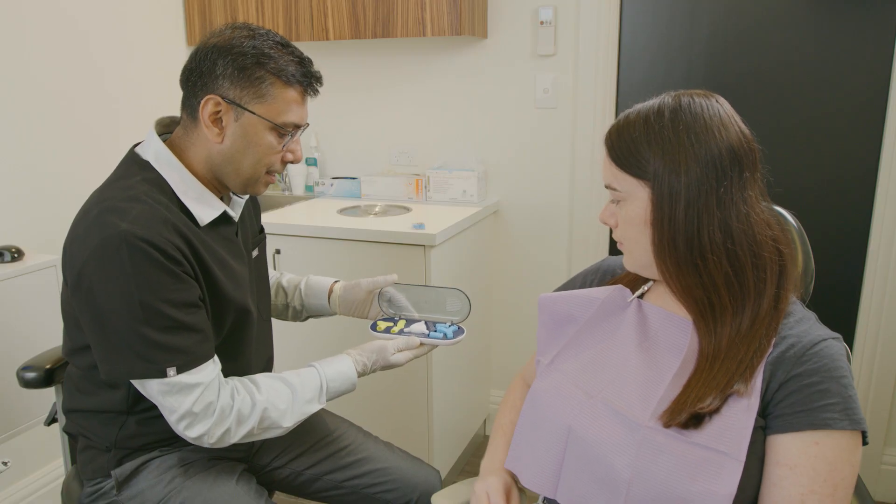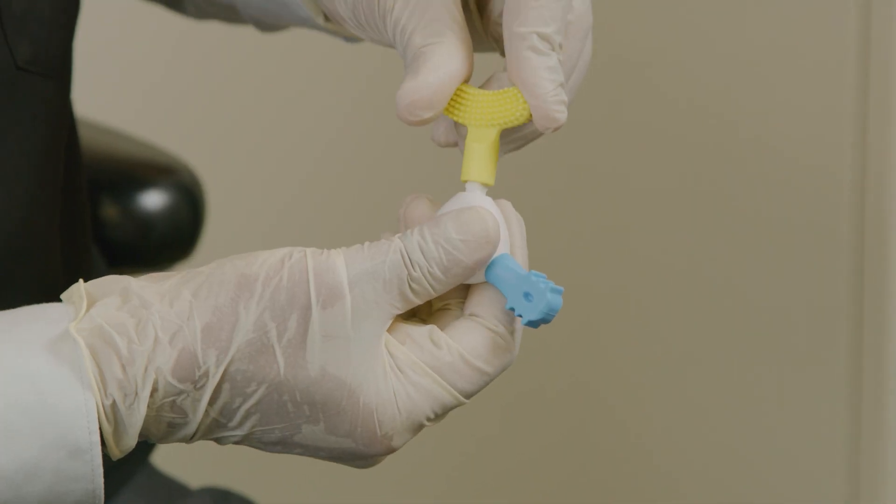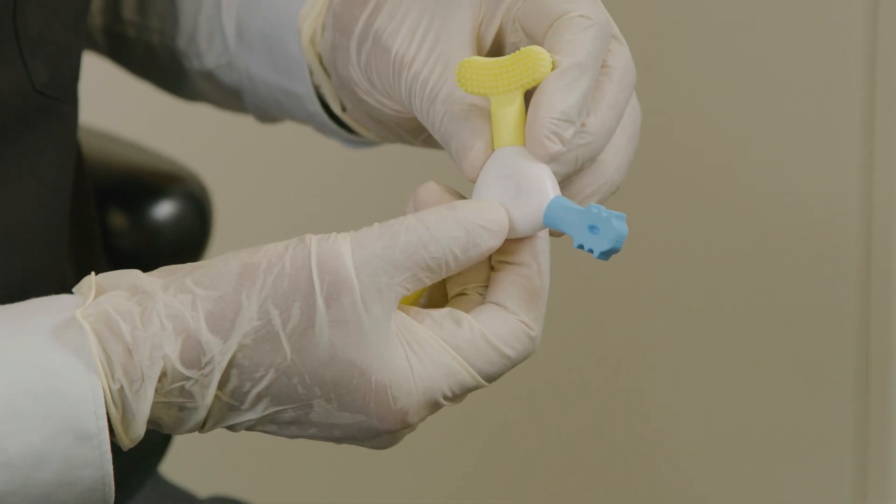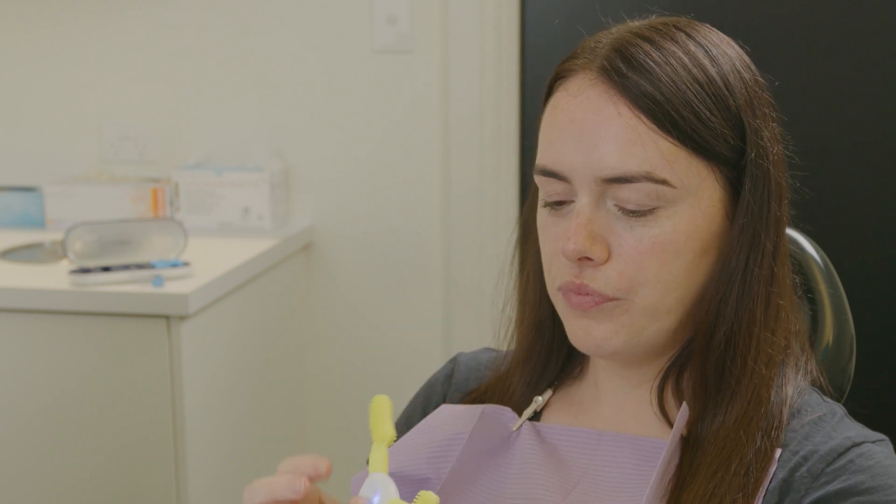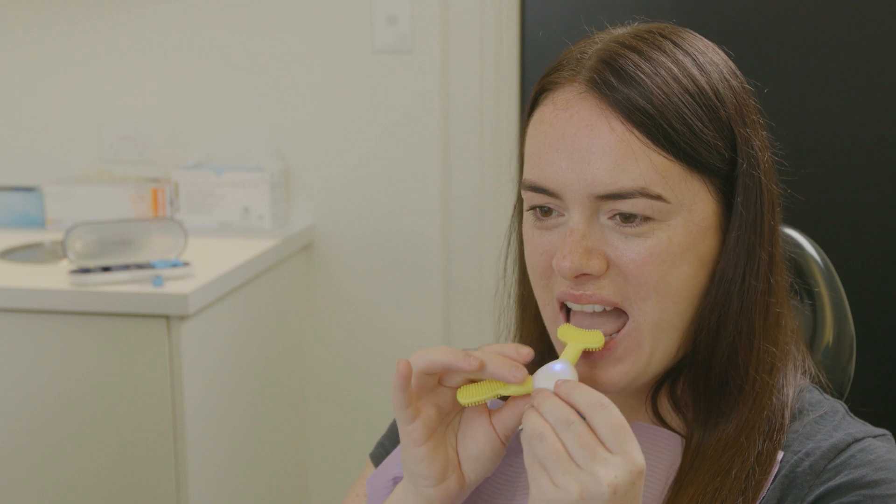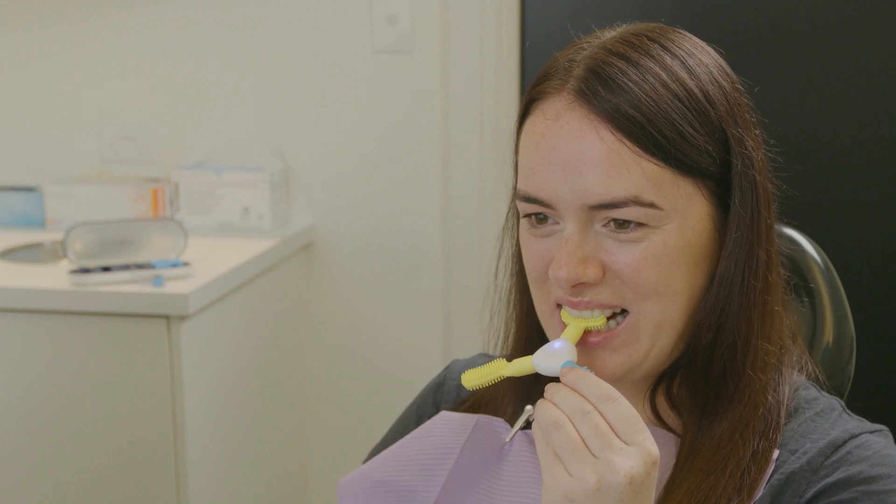The ideal protocol for use is to utilize twice per day for six minutes: two minutes on each side of the mouth with the posterior nodular attachment, and then two minutes using the anterior nodular attachment.